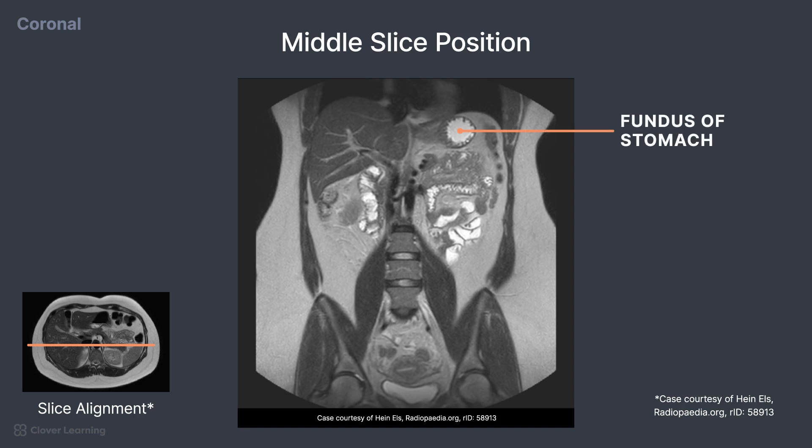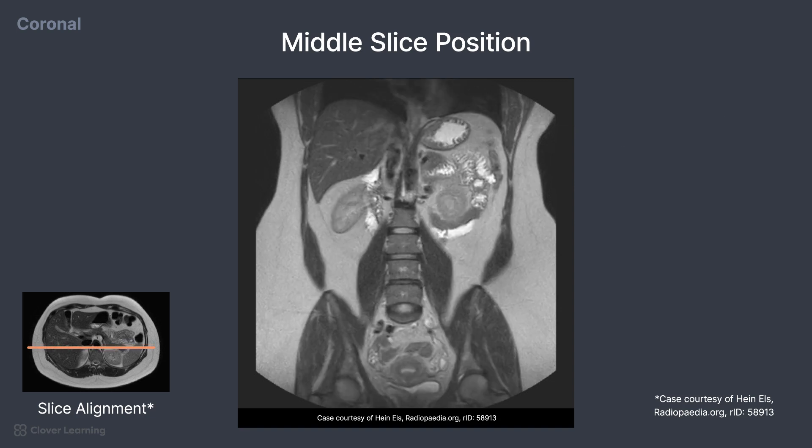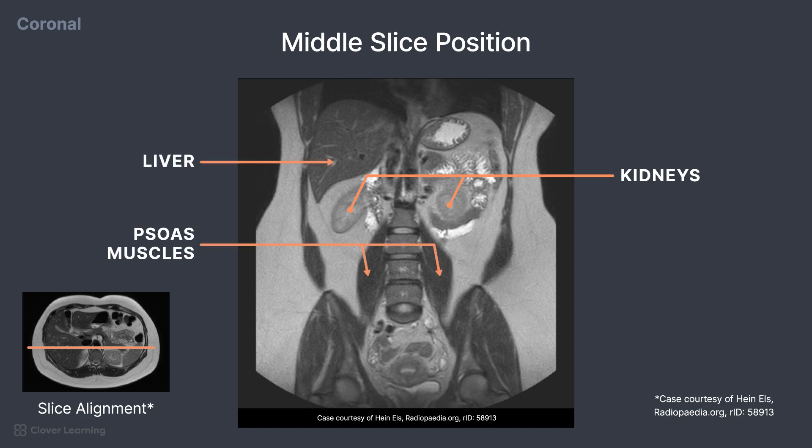with the rounded fundus portion better demonstrated. Now we begin to see the kidneys emerge, just superior to the psoas muscles and inferior to the liver.